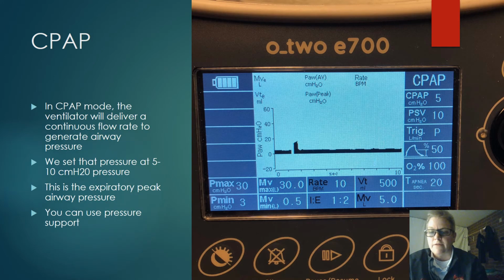Okay, CPAP. We've been using it for years. It's great. That CPAP mode, the ventilator delivers that continuous airway pressure so that they breathe against that expiratory pressure. Helps keep those airways splinted open. We start that at 5 to 10 centimeters of water pressure. You can use pressure support as we have been, like is on this vent right here. We've got a CPAP pressure, 5 centimeters of water pressure, and then the pressure support is set at 10 here.